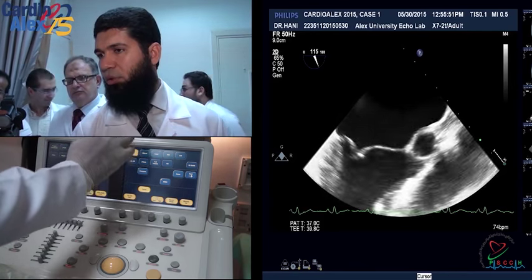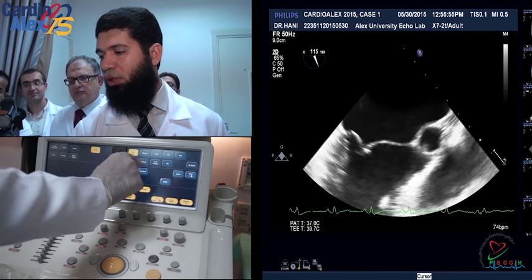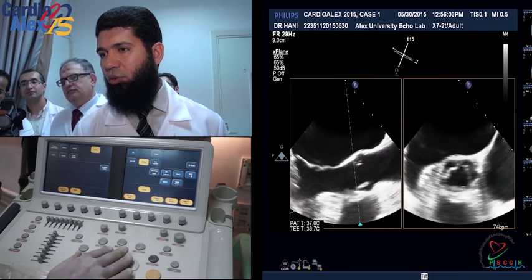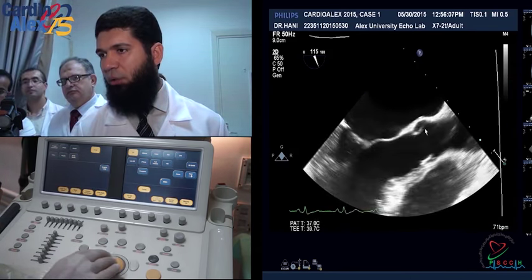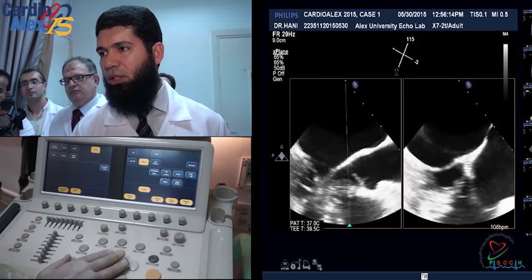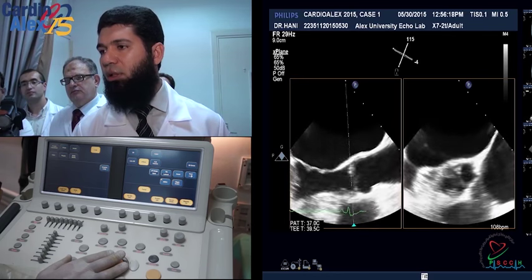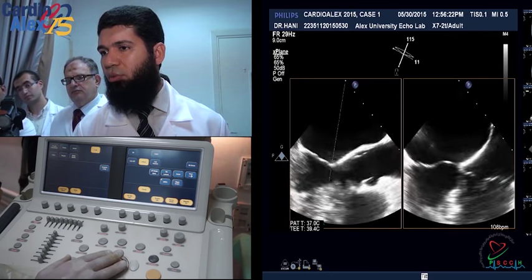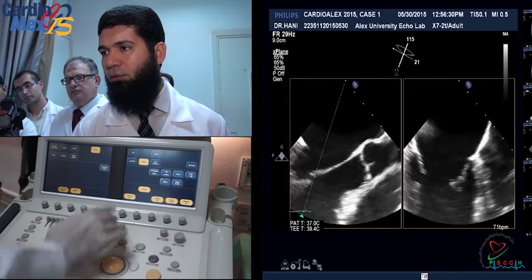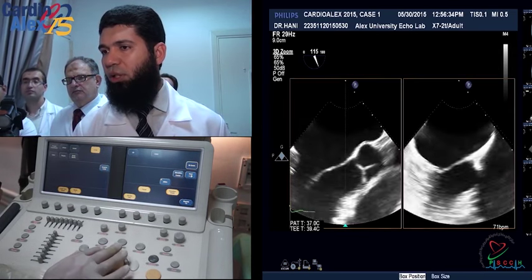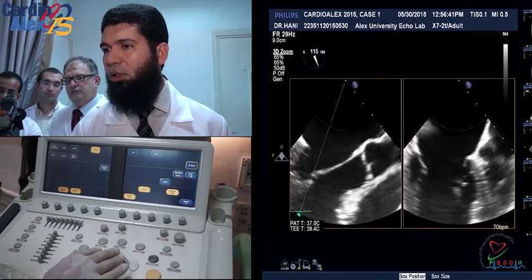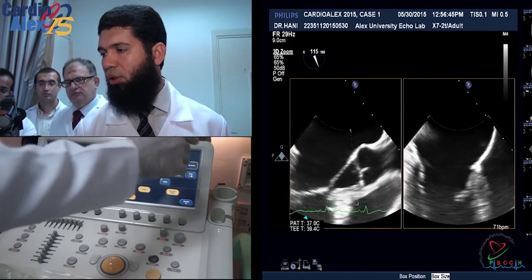From that view I can also use X-Plane — although not 3D, it is one of the capabilities of the 3D TEE probe. By X-Plane, I can move and screen the entire anterior mitral leaflet. For example, the long axis view shows strictly A2 and P2 only. I can position the X-Plane to screen A2 from base near the aortic valve on the right-hand screen — showing the base of A2, mid of A2, and then the tip of A2 — as well as the posterior leaflet P2. From that view I can also apply 3D Zoom — the beauty of 3D is that you can apply it from any view.